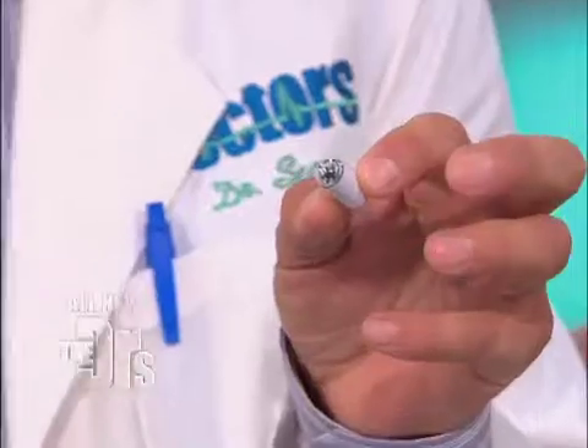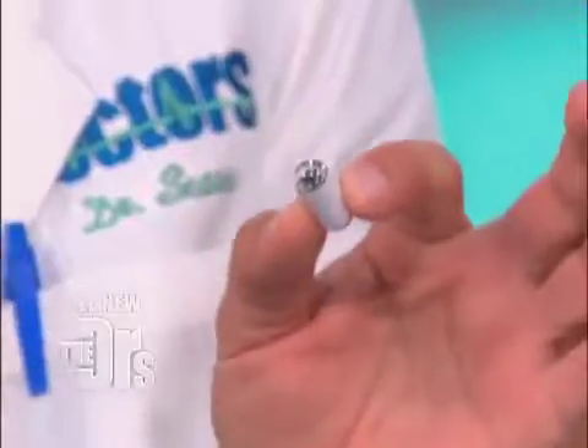This tiny little camera. That's a pretty big little camera — that is kind of big. That would make me gag. This is big for a pill, but it's small for a camera. I hope you're good with pills.